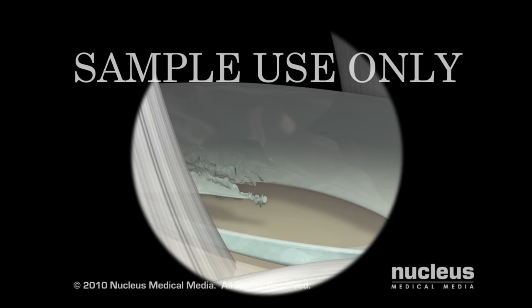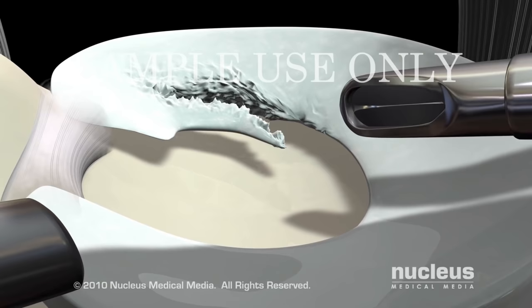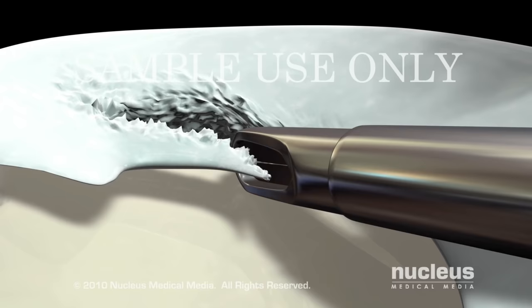Images from the arthroscope's camera are magnified and projected onto a video monitor. Your surgeon will carefully examine the inside of your knee joint, locate the damage, remove any loose or severely injured parts, and use a shaving instrument to smooth any jagged edges.